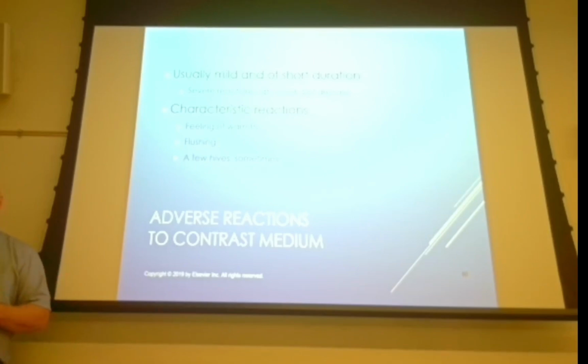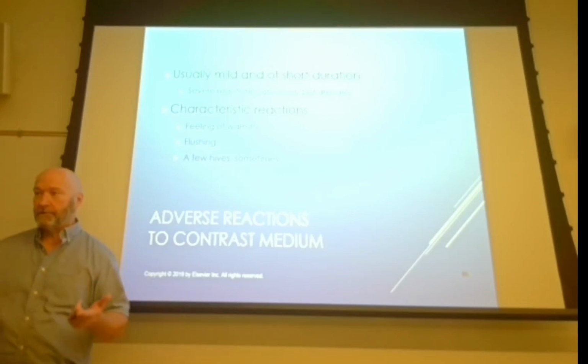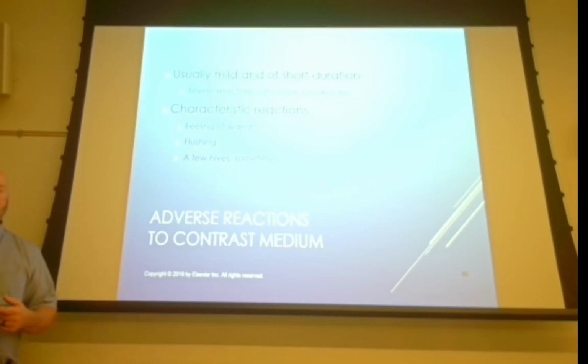Two things that you might want to warn the patient of. One is that whenever you inject the contrast, you're increasing the patient's blood volume by 100 cc's. Those big syringes, big cap tip syringes, are 60 cc's. We're going to put two of those in an adult. So your heart has to react to that, right?